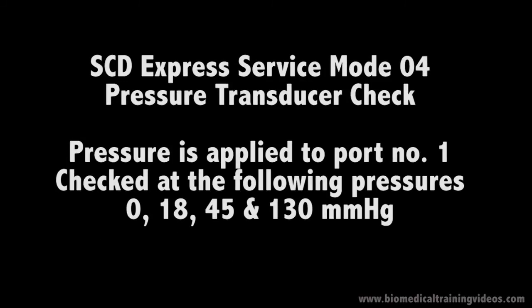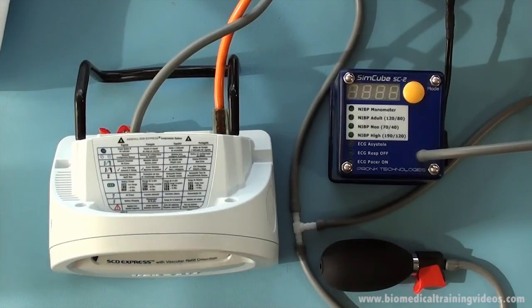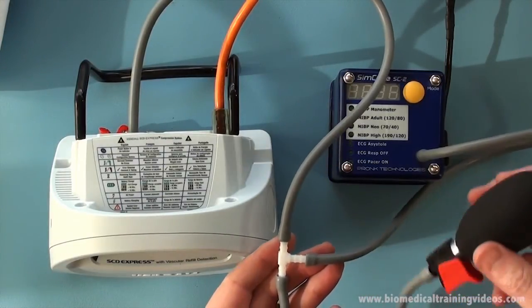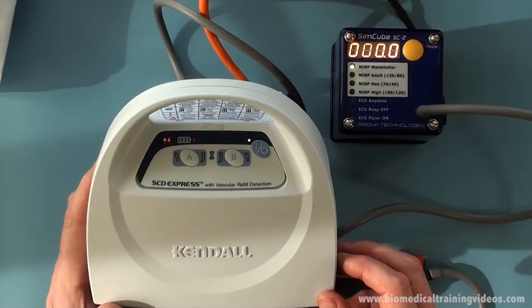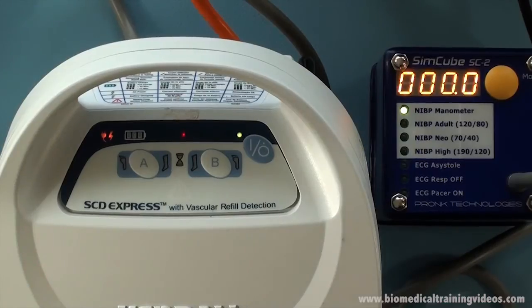Test mode 04 is the pressure calibration check. We apply pressure to the port connected to the pressure transducer internally. The test jig is simply a cable, T-piece, and something to generate pressure — I am using a bulb and a manometer to measure the pressure. It is a fairly simple setup procedure. We start the test and make sure there is no pressure in the circuit.